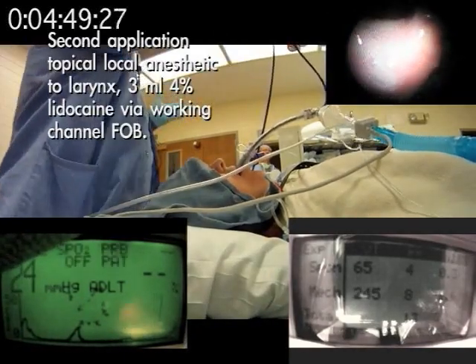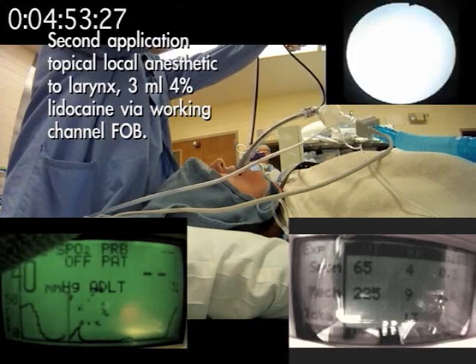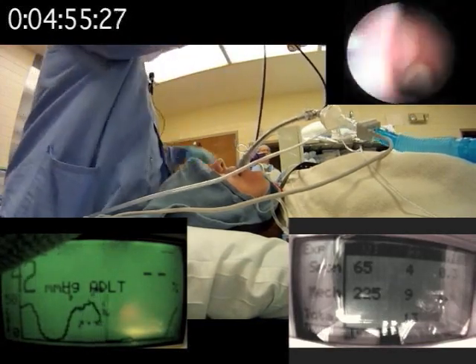I always wait 15 seconds between local anesthetic applications. I'm going to go ahead and give them another one now. There's another one — another local port.